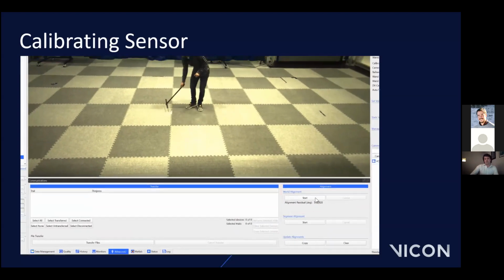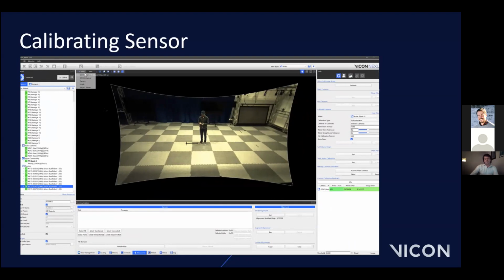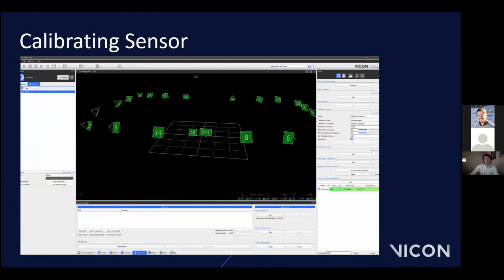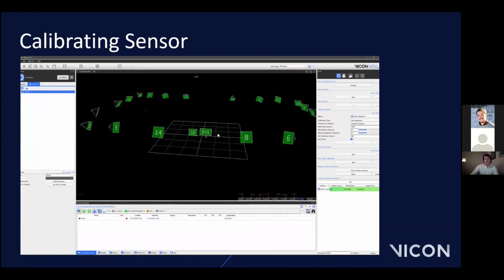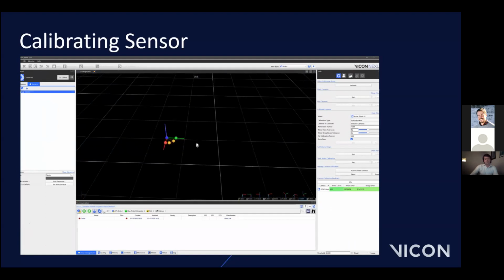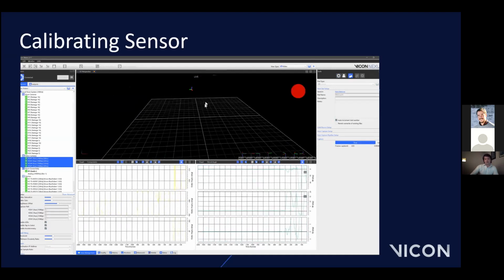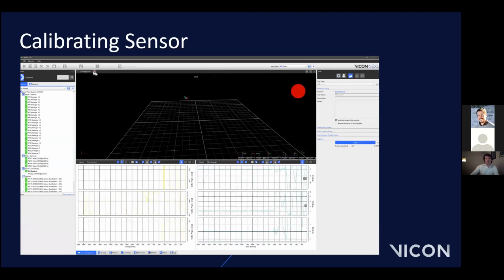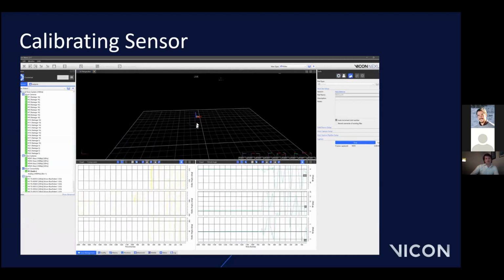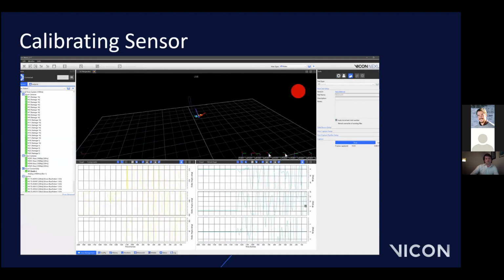The IMU then needs to be allowed to self-calibrate before you can start capturing, which takes about 10 seconds. This process does 2 things. It calibrates the sensor for calculating global angles by taking into account any magnetic interference within your environment. And it also aligns the sensor's global coordinate system with the Vicon global coordinate system. So as you can see here in this video, we've now gone on to start capturing data.